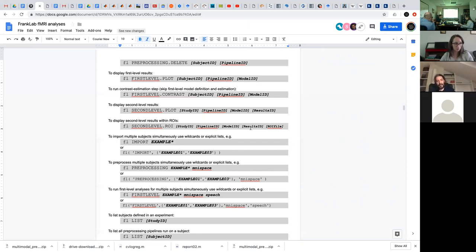It's only because of this subtlety of the residual maximum likelihood approach to the temporal covariance that it actually produces slightly different things. If you are not modeling temporal covariance, for example, when you have a sparse design and you don't model any type of temporal cross correlation, then the two things will give you exactly the same beta values. Whether you do the first level analysis on the aggregated time series or the aggregation at the level of the beta values, you get exactly the same numbers, exactly to the level of machine precision, right? It's only when you do this temporal correlation that it introduces slight variation in these measures. But I'm not sure whether there is any clear rationale to think of one being better than the other.